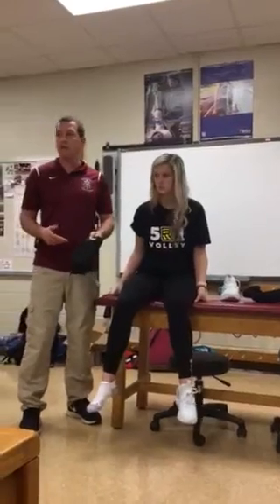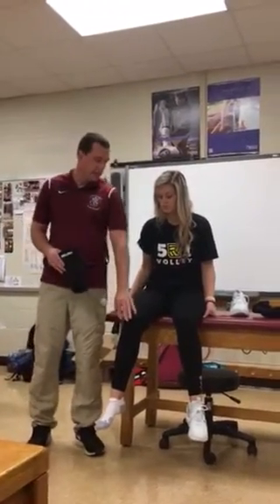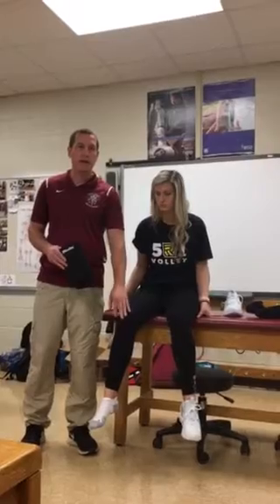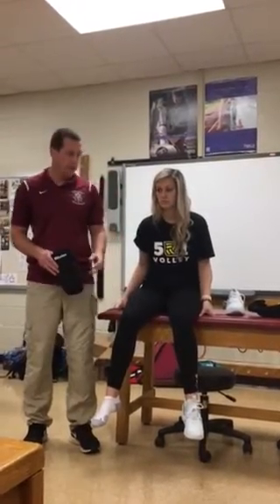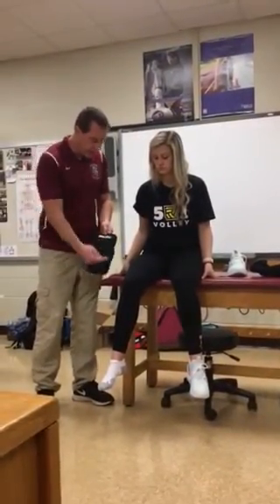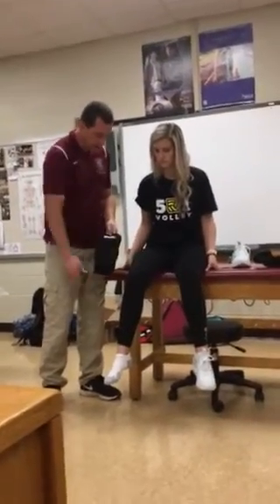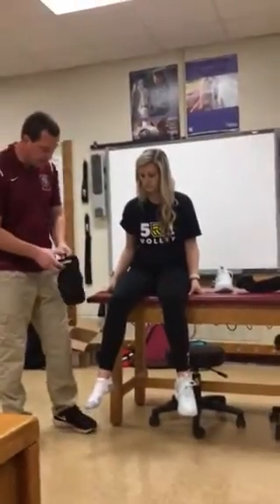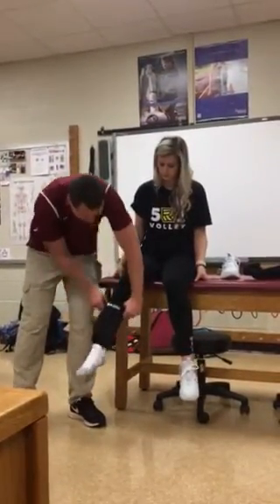You would use this if she had a contusion or some bruising, or if she had a bursa injury which would cause bursitis. Anything where she potentially will still have some contact and we need to give some extra protection over the structures on the anterior. This is a half inch pad. We're going to put the wording proximal, so higher up, and because this is tapered, she's just going to put this on and slide it all the way up.